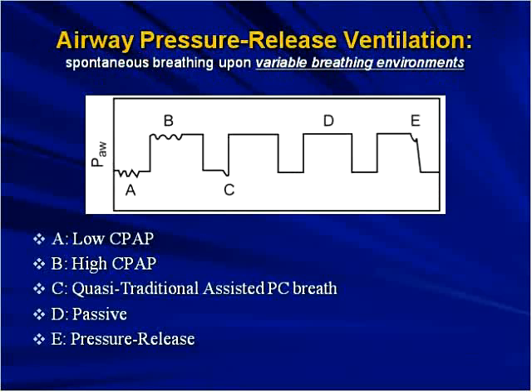Basically, airway pressure release ventilation is 2 levels of CPAP, a high and a low CPAP, and the changes between these two can cause a tidal volume change, and the patient can actually superimpose their spontaneous breathing effort on top of that, and that supposedly deals with the issue of asynchrony. If the patient can superimpose their breathing pattern at will, then we've kind of solved the asynchrony issue. That really isn't true, but that's the idea behind this.